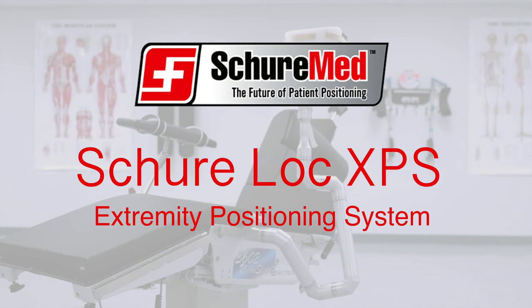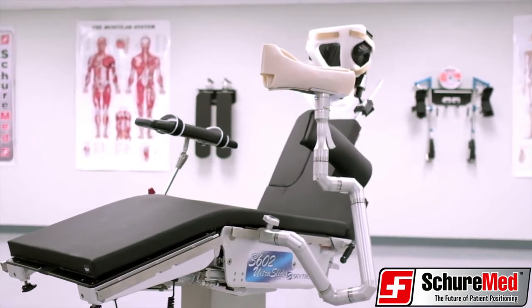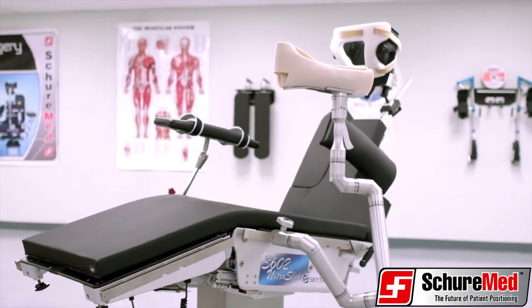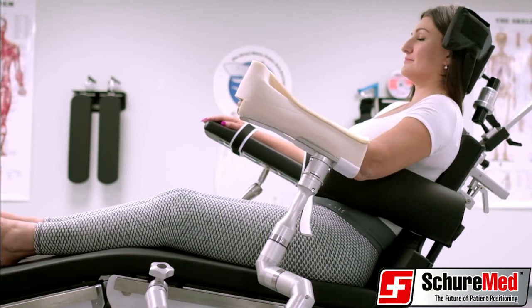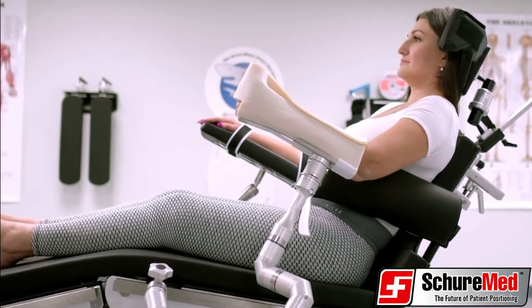Today we are highlighting SureMed's SureLock XPS. The SureLock XPS is an extremity positioning system providing rigid fixation as well as an unlimited intraoperative range of motion for total shoulder replacement, shoulder arthroscopy, and rotator cuff surgeries.